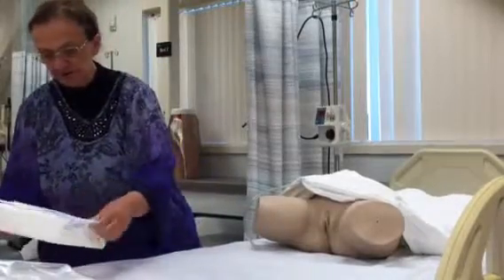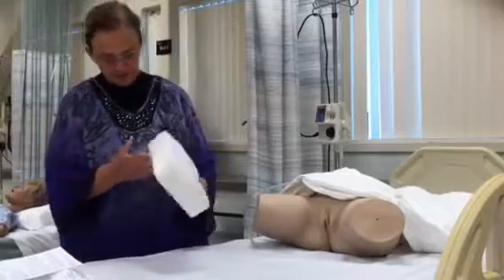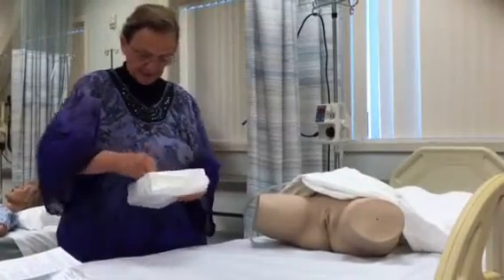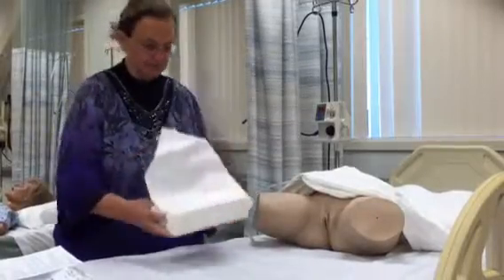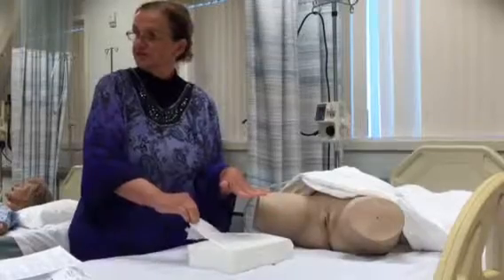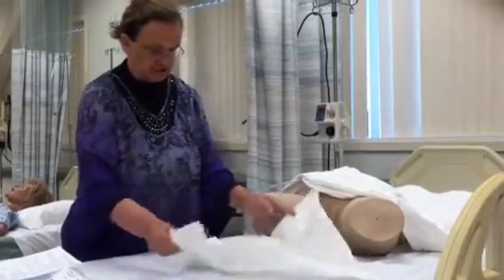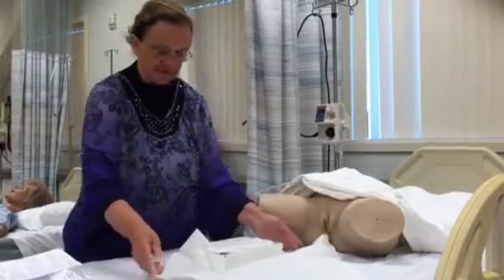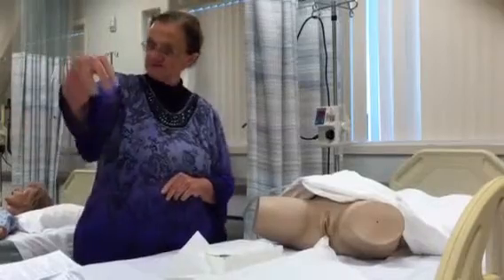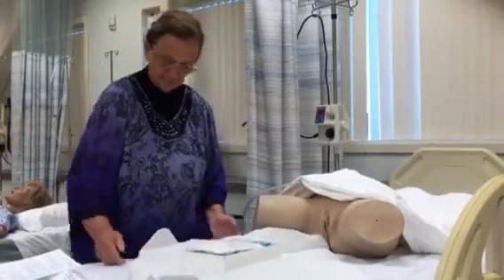Now, whenever you open up a sterile tray, you always want to open up away from you. Okay, you always want to open up away. So I'm going to take the tape off, and this is going to become my drape underneath, all right? So I'm going to open away. I'm going to do the two sides, and remember, anything on the outside or the edges is considered contaminated. So this last flap I'm going to grab like this.